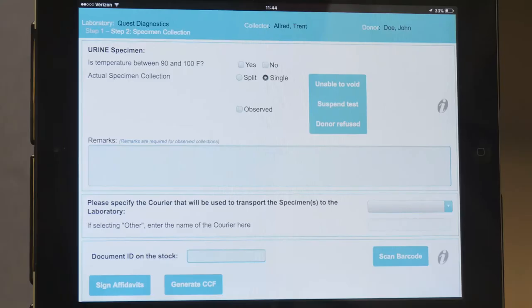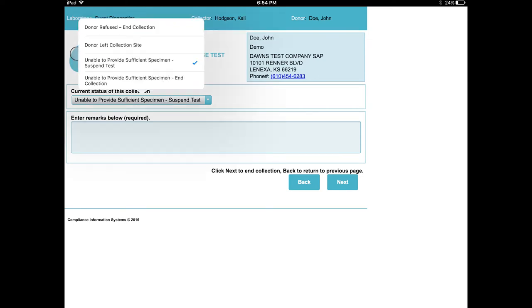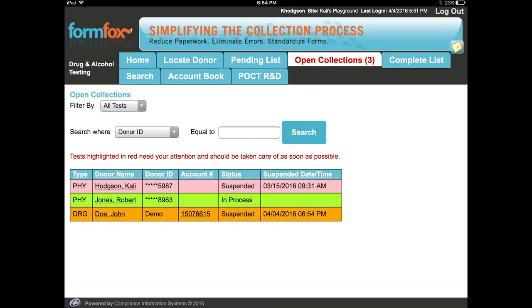On the next screen, under Current Status of this collection, tap the down arrow to the right of the list. Select the appropriate status from the choices provided. Add required remarks in the space below and tap Next. Choosing to suspend the test indicates that the donor will re-attempt to provide a sample at a later time. Choosing any of the other options will end the collection. Remarks will always be required. A new collection container will need to be used when the donor is capable of voiding. To reopen the test record, use the Open Collections tab and select the name of the donor from the list.